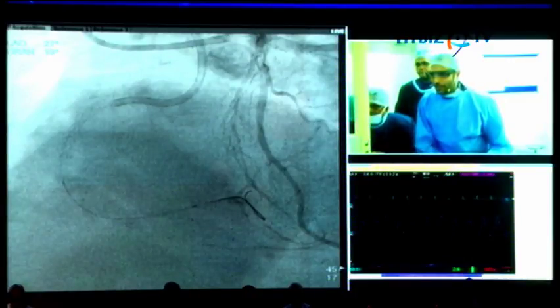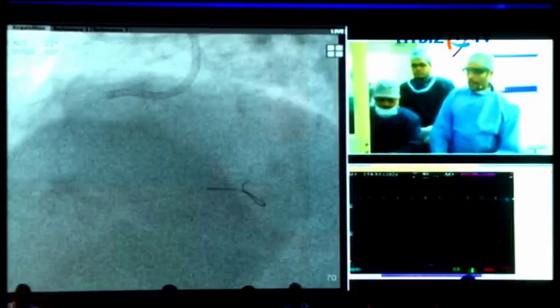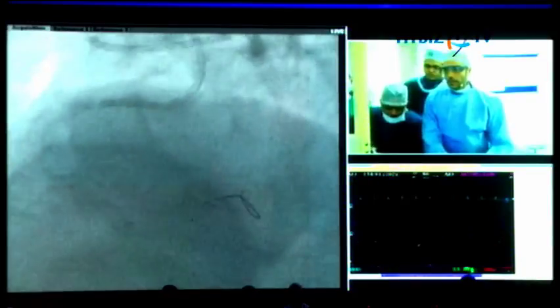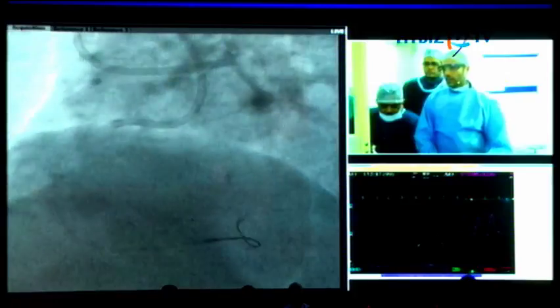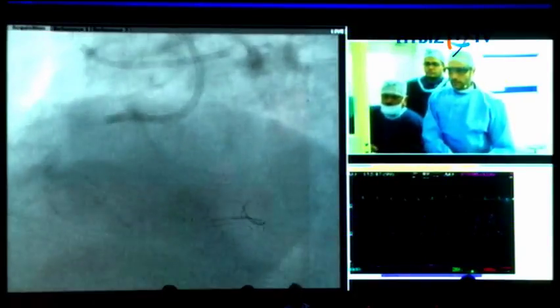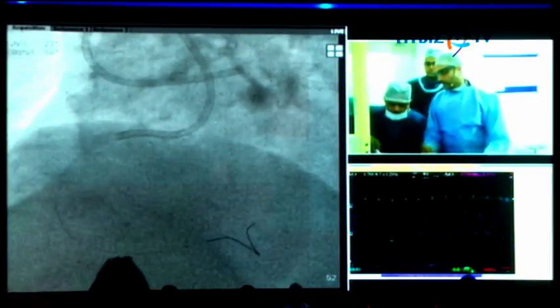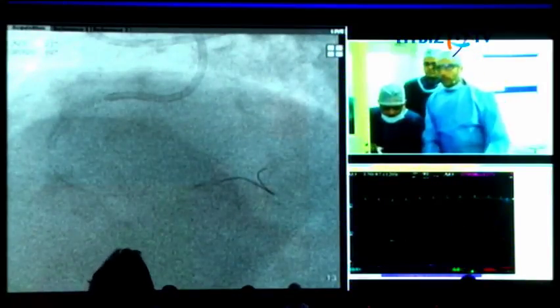Maybe I'm subintimal. I don't know. Actually, your balloon has reached where you are now. Okay, go up. Okay, go up. 6, 8, 10. All right, okay, deflate. Okay, 12, 20. Let's just do 20 inflation all through. Just go 20, it's fine. We're just going to balloon the whole track, guys.